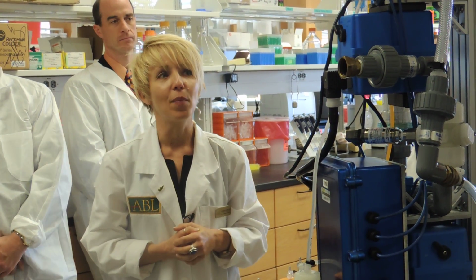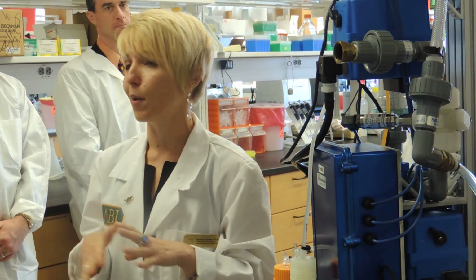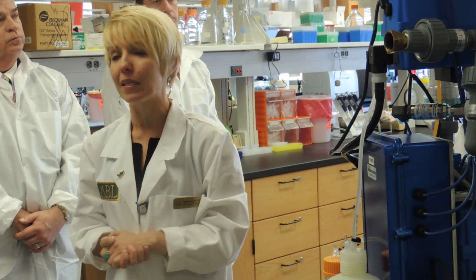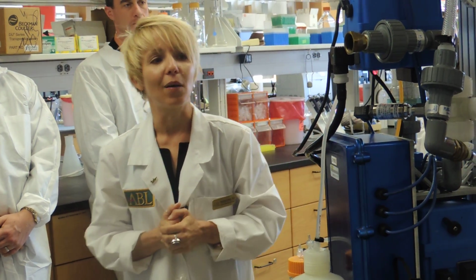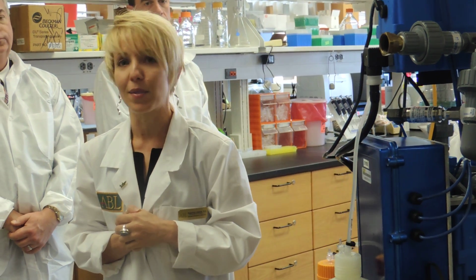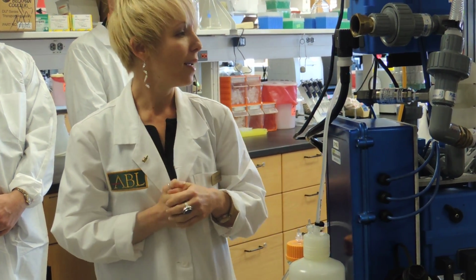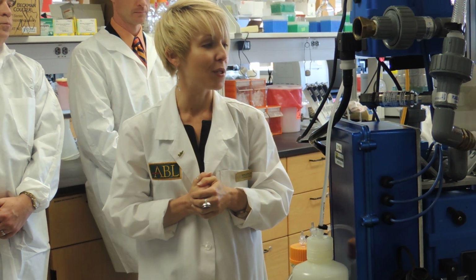So once the incubation has begun, the computer will take the timing and monitor how long. We have a certain process that we've developed here that has worked fairly well across a variety of sample types. Once the incubation has been completed, and this is on a little tighter scale for demonstration purposes today, the fluid that was incubated will then be removed from the filter, and this is part of our patent pending concept here. This next portion of the process, the extra fluid will then be removed from that filter. And once that has been done, you will be alerted by the software that it is time to recover our sample.